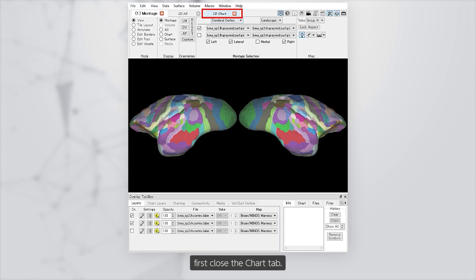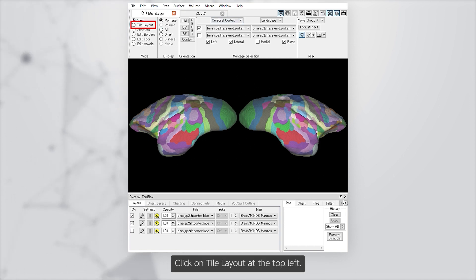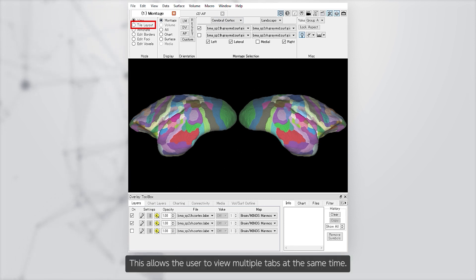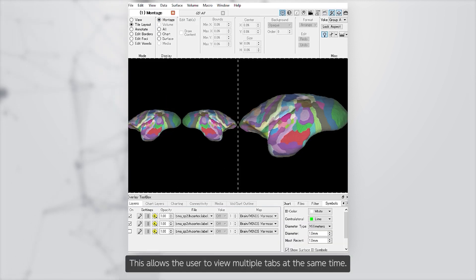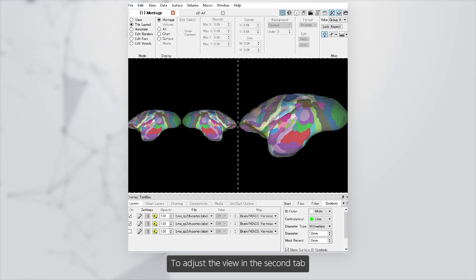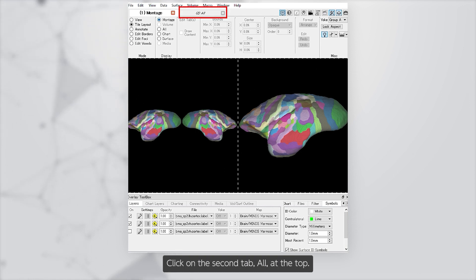First, close the Chart tab. Click on Tile Layout at the top left. This allows the user to view multiple tabs at the same time. To adjust the view in the second tab, click on the second tab at the top.